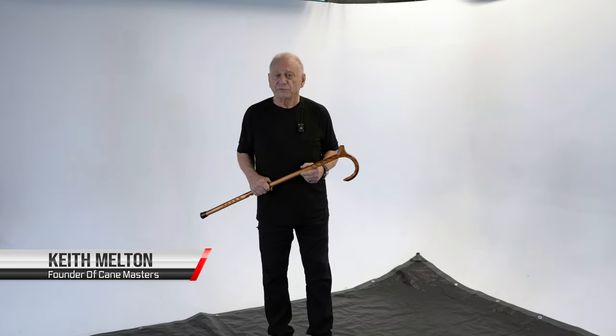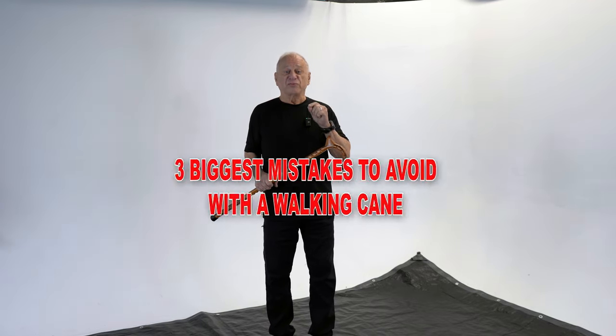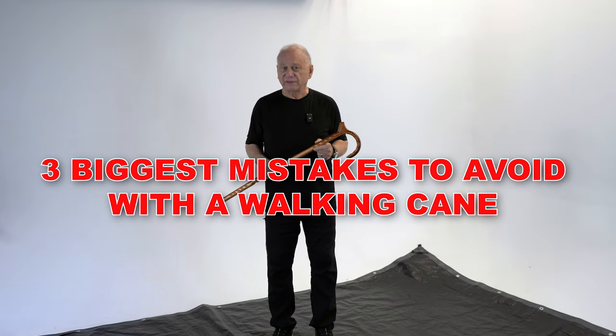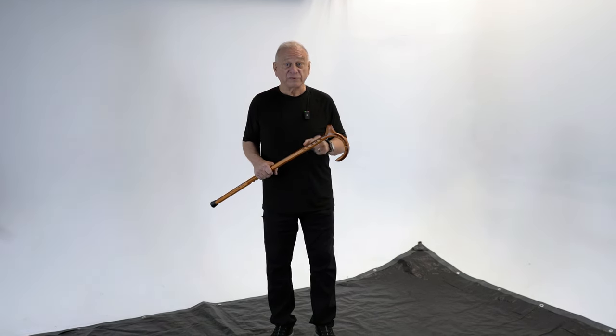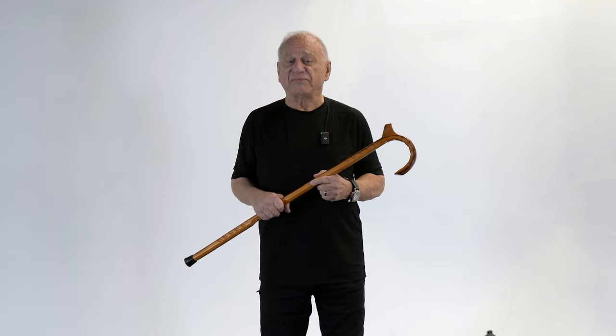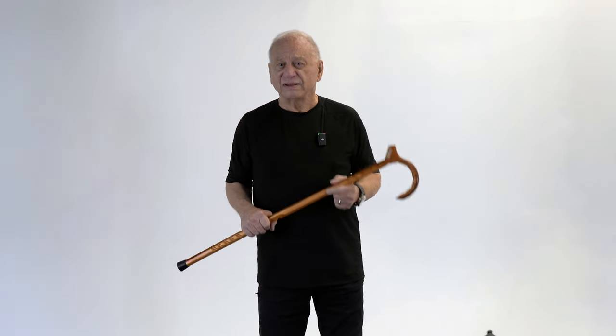Hi, I'm Keith Melton. I'm the founder of the new Canemasters company. Today I'm here to talk to you about the three biggest mistakes you want to avoid when using a cane. Canemasters makes the finest handcrafted canes in the world in South Florida. Nothing's imported. Each cane is made for you, and it's the very best quality you can buy. But let's get into the mistakes and how you can avoid them.